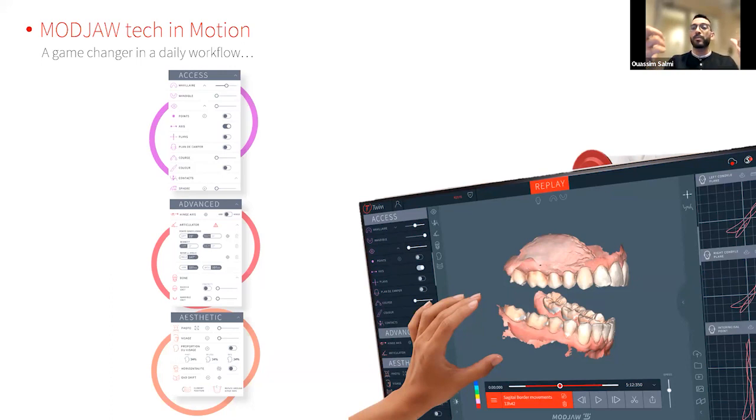You can explain to the patient why you have this weird facet, why you need to adjust that, why you need to change that. It gives you an image to explain that, and not just a color inside the mouth of the patient. For Advanced, it's more to push the use of the software where you have the tracing combined with the 3D models, the virtual articulated parameters, and you can add the CT scan inside if you want.